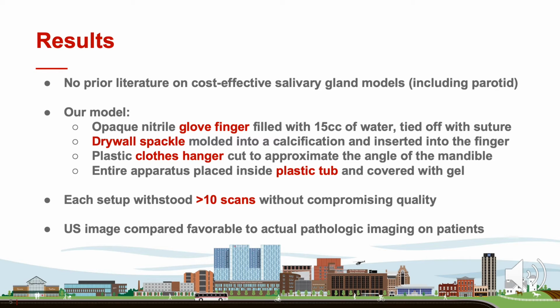And finally, our ultrasound image did compare favorably to actual pathologic imaging on real patients. And that was one of the most important outcomes for us, was ensuring that our ultrasound images were actually representative and that these medical students were getting an accurate image of what they would see as a practicing clinician doing ultrasound of the head and neck.